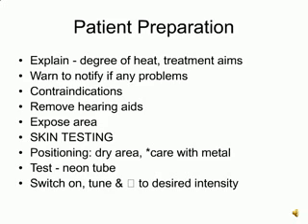The area should be adequately exposed and the skin tested for thermal sensation. The patient should be positioned in such a way that moisture cannot build up on the skin surface, as this will heat preferentially and may present a risk of burning. Metal will also heat preferentially, so metal plinths or chairs should be used with extreme caution. Normally, wooden plinths will be used.